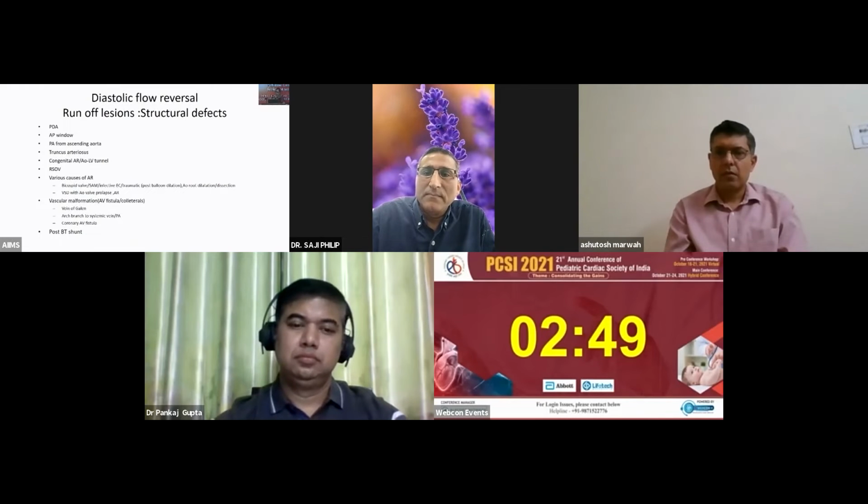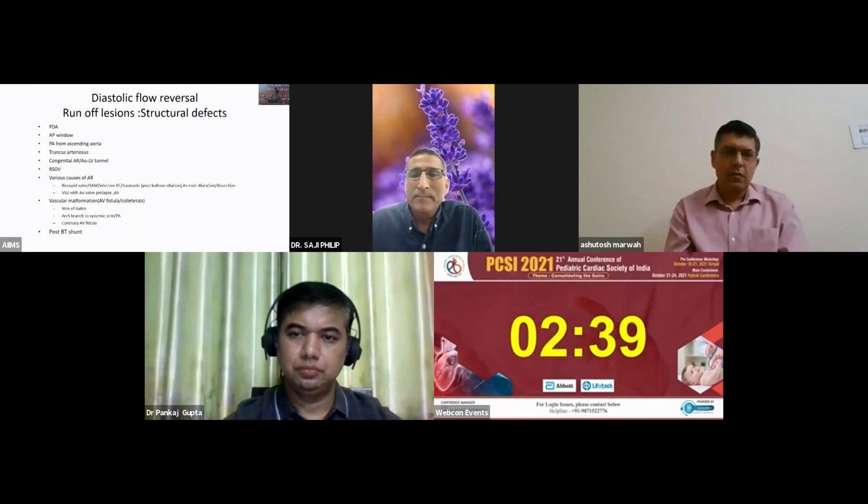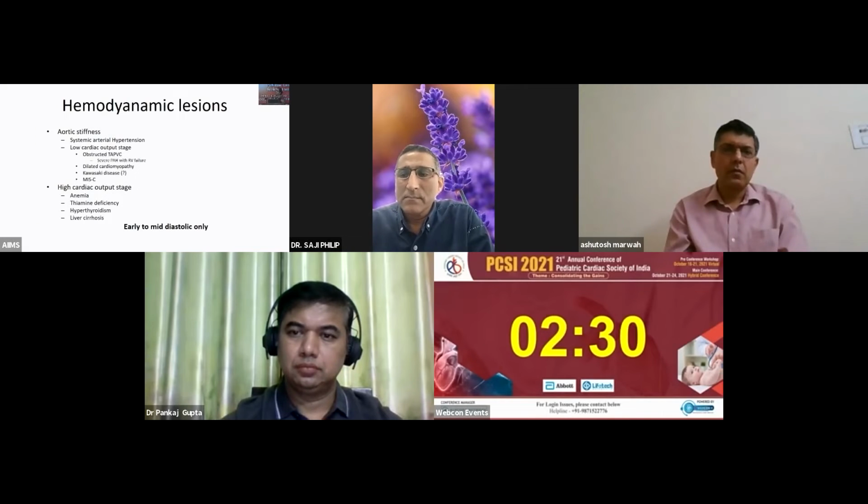Extracardiac causes are vascular malformations, vein of Galen, branch PA from ascending aorta, coronary fistula, and the BT shunt. So these are the structural causes. But beyond structural, there are other hemodynamic causes which will also lead to diastolic flow reversal into the aorta. The list is long, but always these are the significant causes. If flow reversal is there, you need to find the explanation for that.